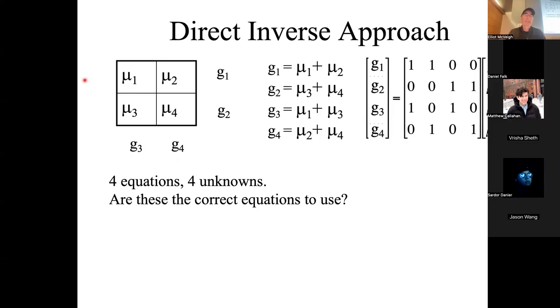To do so, we take projections. So we set our angle and we project x-rays this way, right? And we get a measurement here, G1. So we're going to take the measurement. We'll divide it by the measurement we got when there was nothing there, right? That I naught. And we'll take the minus log, and that gives us that G value right there. And so we know from what we derived before that this G1 is equal to mu1 plus mu2, just by definition and by the way we've constructed this thing, right?